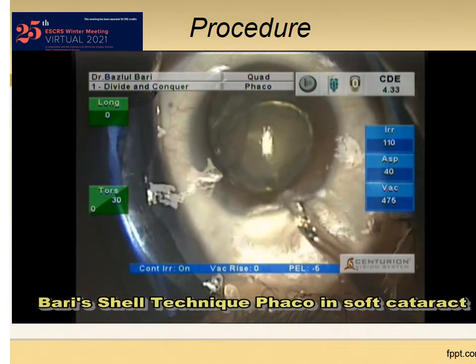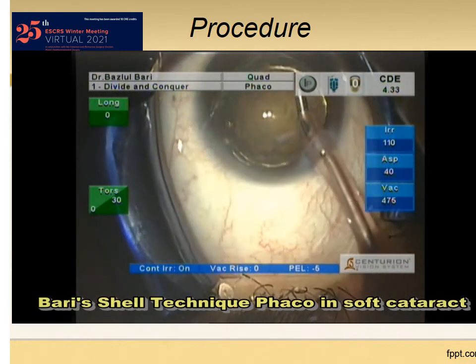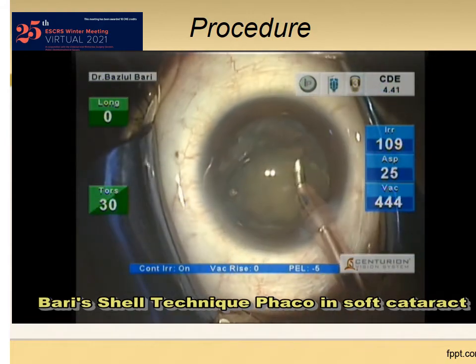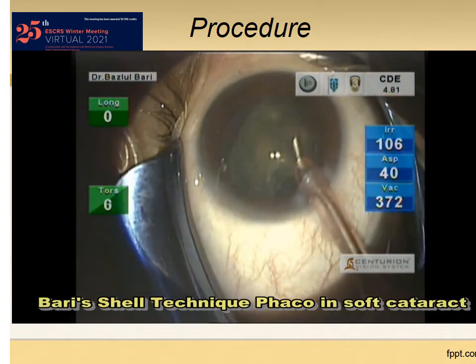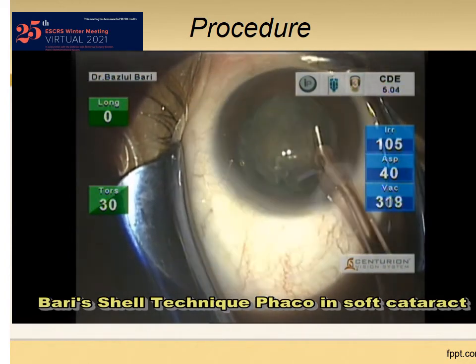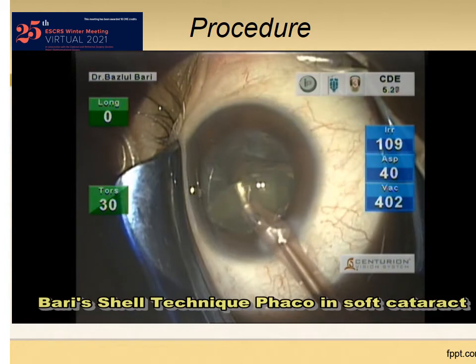I am directly catching the free nucleus with the FACO tip and emulsifying it. The shell is observed preventing forward bulging of the posterior capsule and thus protecting it.